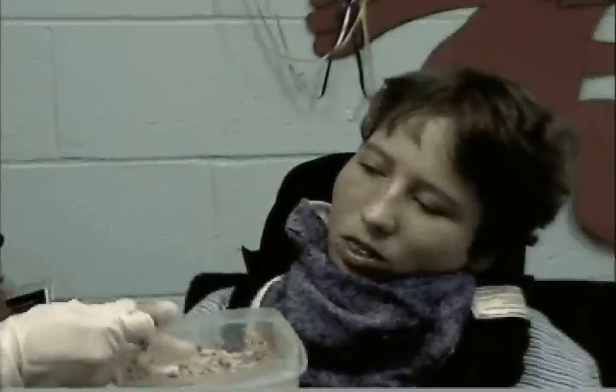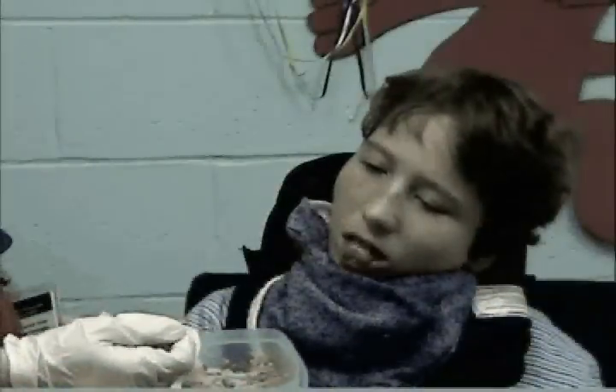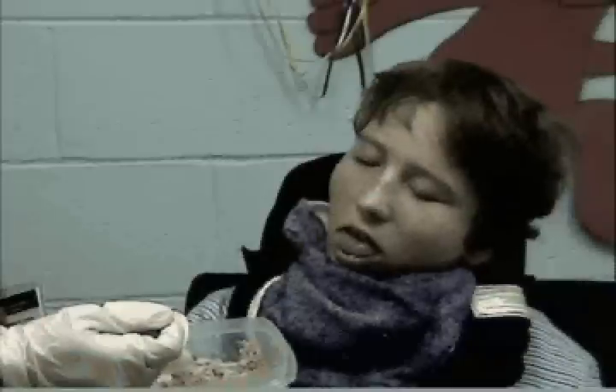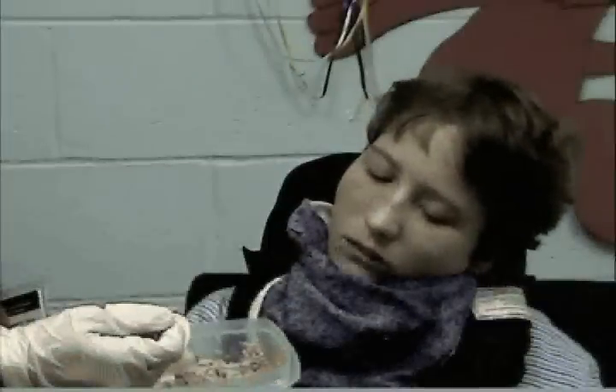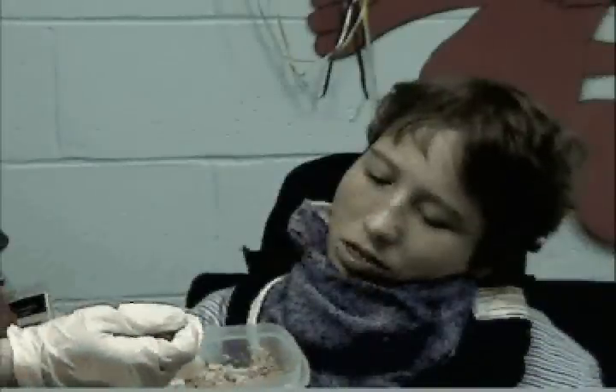You can see that her whole body is at rest now — she's not having to use all her strength to try and hold her head up. As Maureen mentioned before, it is an endurance thing too. If you don't have to expend all your energy trying to hold your head up, then you have it available for other things.